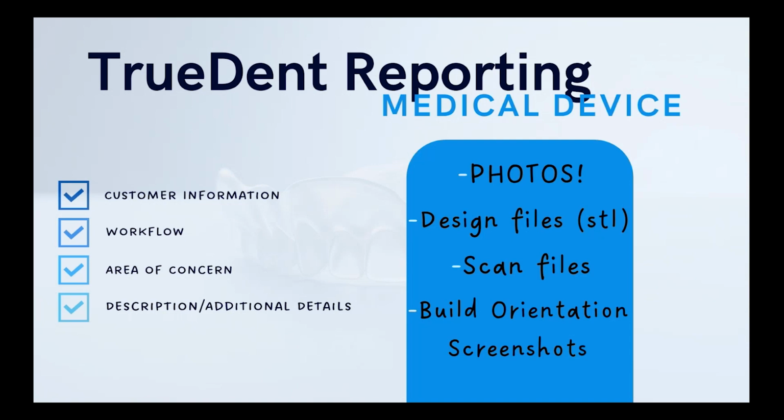So we are talking about TrueVoxel today, so we want to hit on some TrueDent reporting highlights. Since they are a medical device, we just want to be very explicit with what we request from you guys and what you provide for us. So customer information, this is mostly for a reseller that would be calling in: who the customer is, the address, contact, email, that kind of stuff.